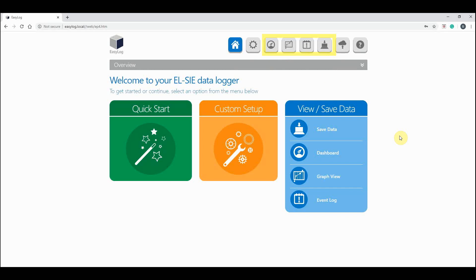From the menu you can choose to save your recorded data, visit the dashboard, view all data in a graph, and access your event log.